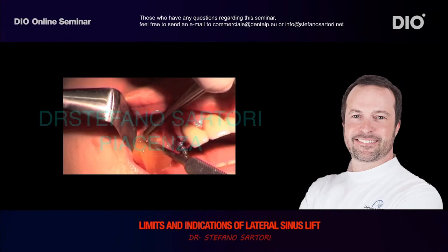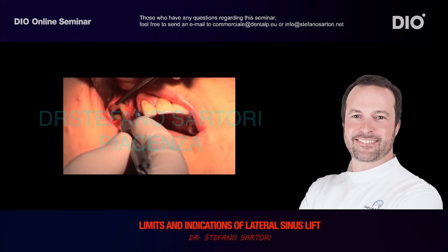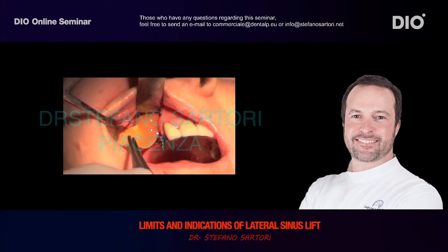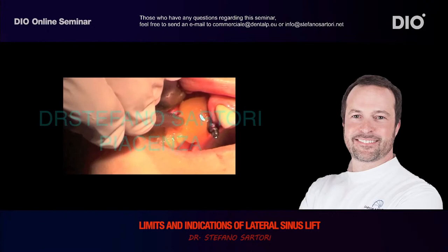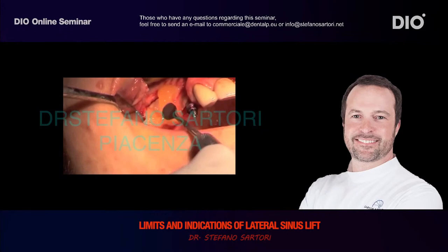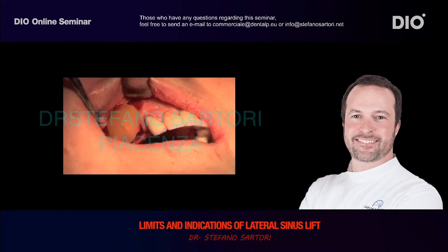Look at these layers. The closure of the Schneider membrane. This is the third layer of PRGF, and then this is the block. The block is surrounded by a PRGF membrane and then positioned with a hammer, very gently. Look. Everything is covered with some layers of PRGF. And then look at the re-entry after 7 months.